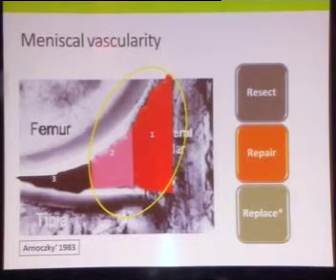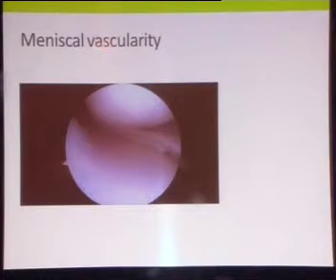So if you have a patient who has got a tear here, try repairing the meniscus, because this is a very vascular zone and the meniscus does heal. And now these days, those who are performing more and more arthroscopy know that it heals. If it is here, you can take a call. If it's a younger patient, you can repair. In an older patient, probably you can excise, and this should always be excised.